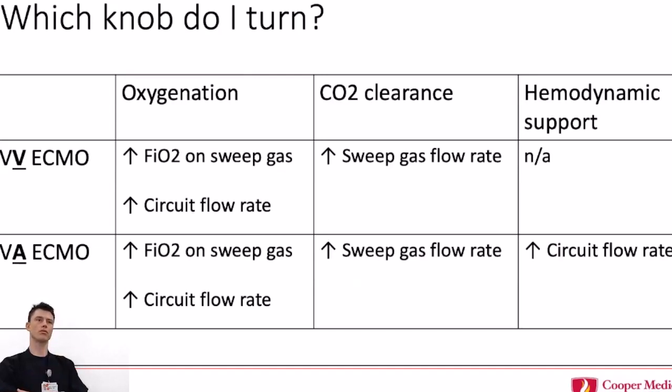When we started in COVID, a lot of us looked at it as, we've got to get them on ECMO, and we've got to get them off as soon as possible. So if we let their PCO2 be very high but their pH is okay, then we can at least get them off ECMO and they can be on the ventilator. Whereas I think we've seen more success trying to make things as normal as possible, and then wean the ventilator, wake them up, and get them moving. I don't know if you have other thoughts. No, I agree.